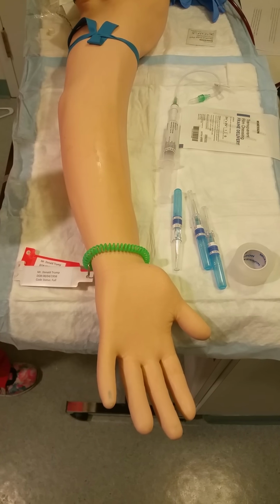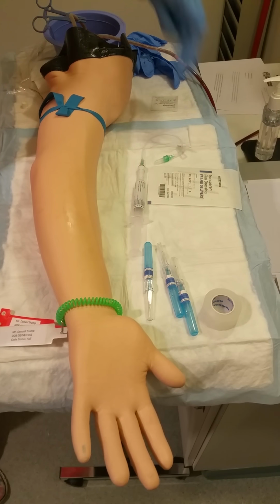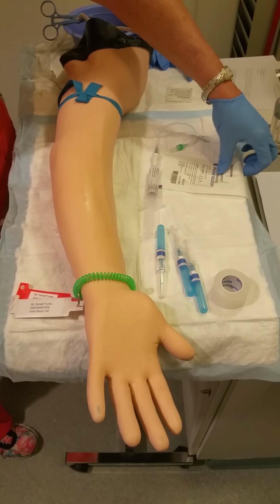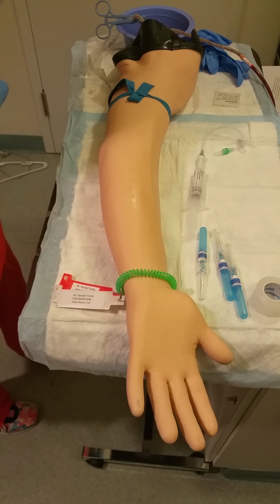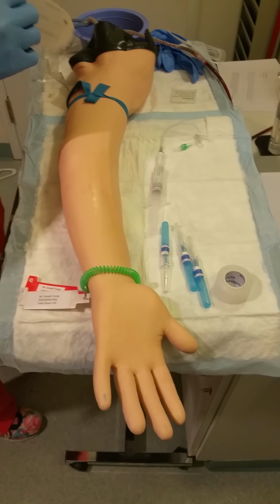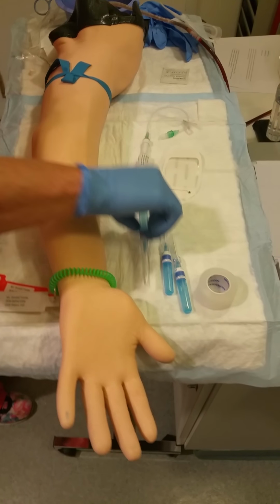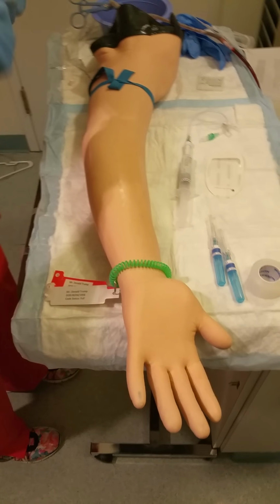Now I'm just going to do a double check of my equipment. My saline lock is ready. I have a gauze 2x2 to blot if any blood drops escape. I have my transparent dressing. It's good to open these ahead of time. I have it ready. And I'm ready for my puncture. The vein is nicely engorged.